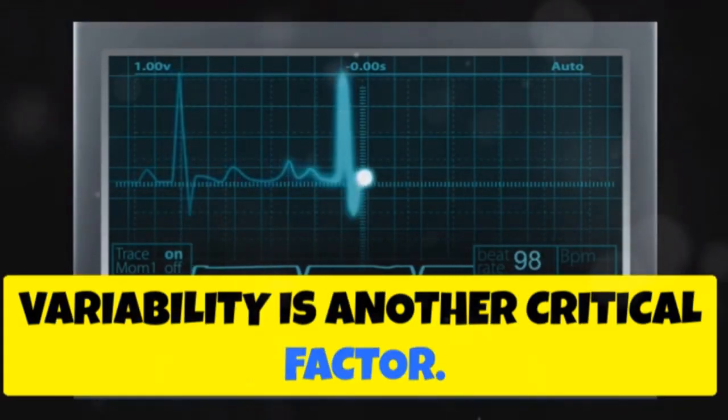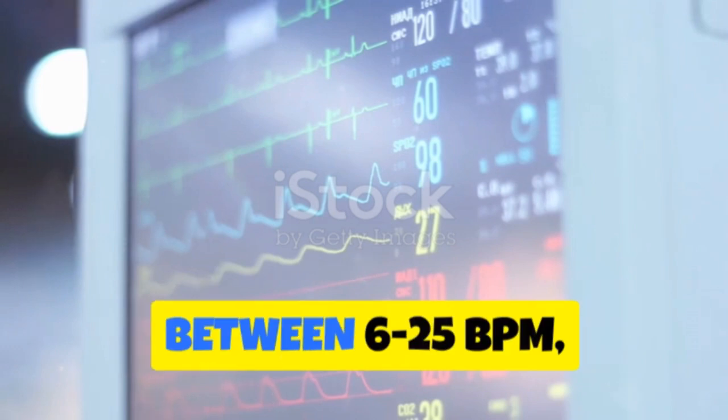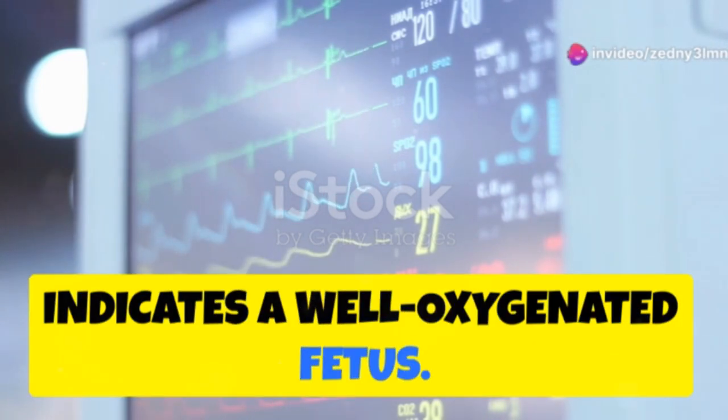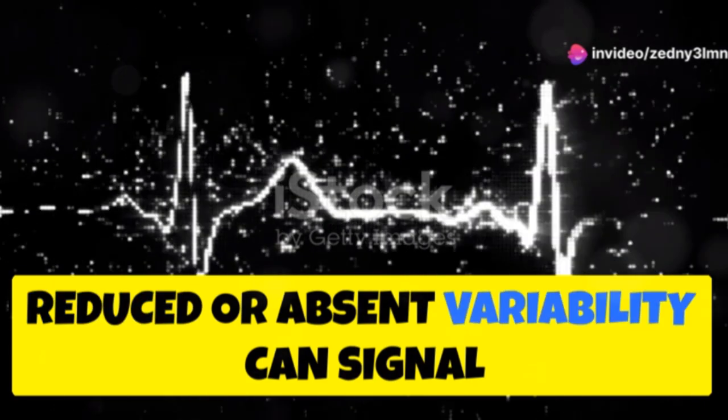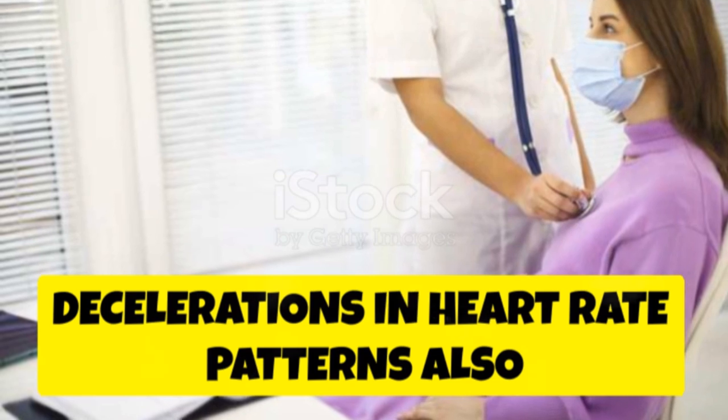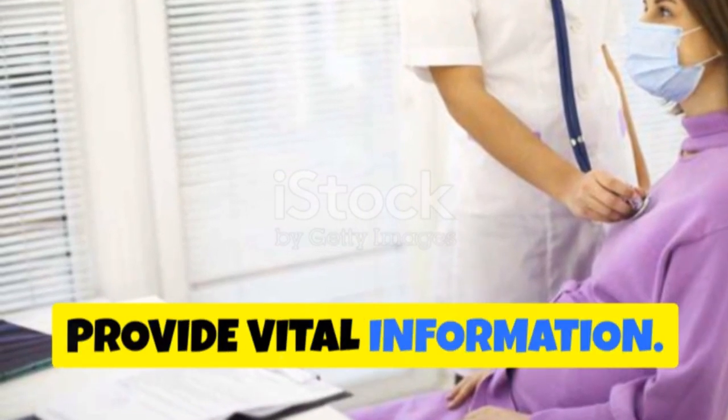Variability is another critical factor. Moderate variability between 6-25 bpm indicates a well-oxygenated fetus. Reduced or absent variability can signal fetal distress or other issues. Decelerations in heart rate patterns also provide vital information.